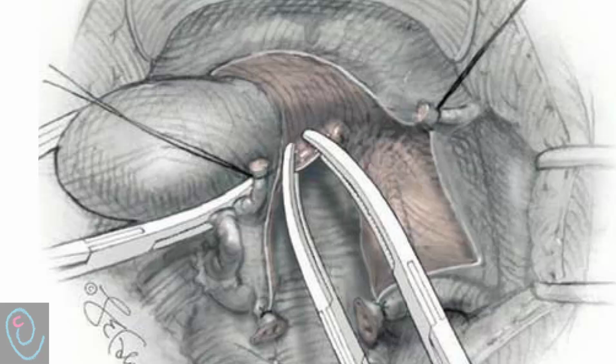The clamp tips are placed horizontal across the vertical uterine vessels. A Kelly clamp is placed medial and vertical to the first clamp and hugs the lateral uterus to prevent bleeding from the severed vessels. Then the tissue between the clamps is cut. A simple stitch of delayed absorbable suture is placed below the Heaney clamp tip. As the knot is secured, the Heaney clamp is slowly opened and removed, while the Kelly clamp remains to prevent bleeding from the severed vessel. A large pedicle may be tied twice to ensure ligation.